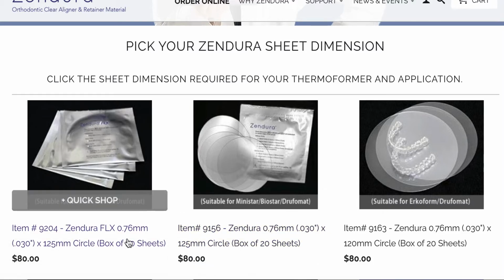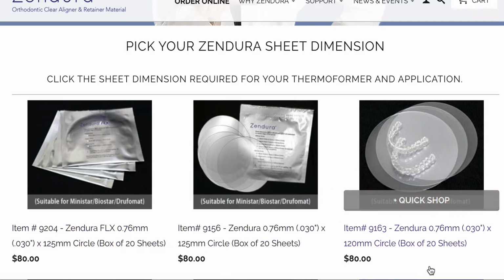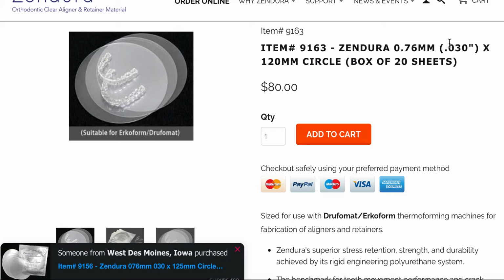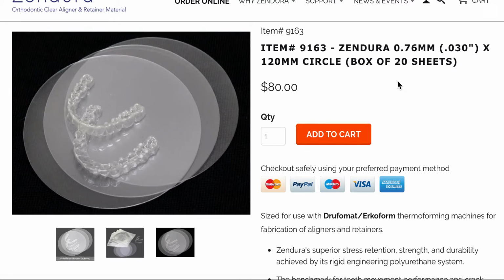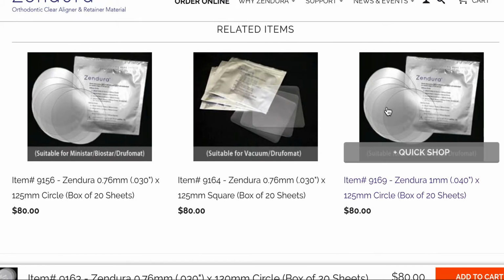So you can see that these are 0.76 millimeters, so that's 030. Most people reference it in inches, which is 030, 035, 040. Usually, for me, the 030 is really more for moving teeth. I tend to use the 040 as my preference for retention. It's just thicker. It lasts longer. It's a little more bulky and a little hard to get off, but that's just my personal preference. Some people will use thinner ones. You're going to have to replace it more.